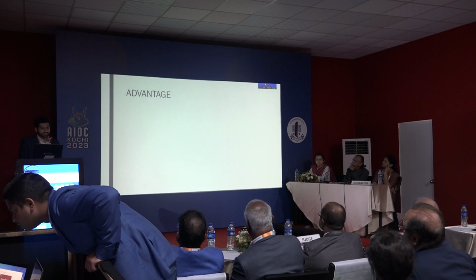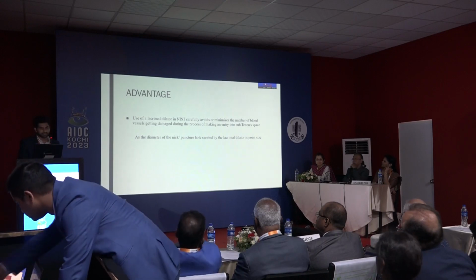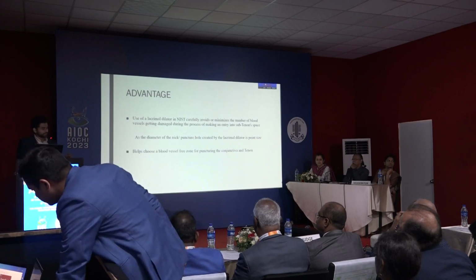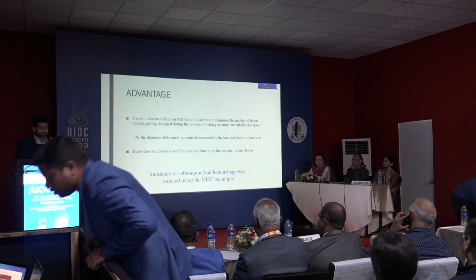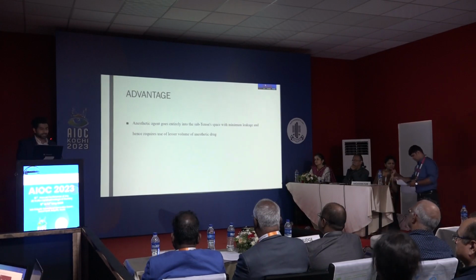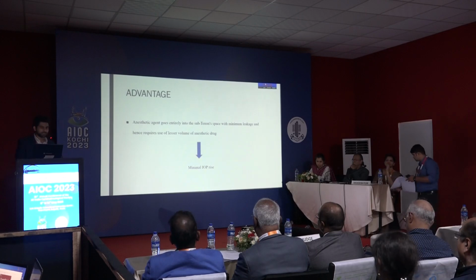The advantage of this technique is that since we are avoiding the dissection, blood vessel rupture in this scenario is very less, which leads to less incidence of subconjunctival hemorrhage. Also, the point entry makes it possible to localize an area which has fewer blood vessels. Also, since the point opening snugly fits the viscoelastic cannula diameter, the amount of drug coming out is less, due to which we have to inject less drug, and it inadvertently leads to minimal rise of IOP.